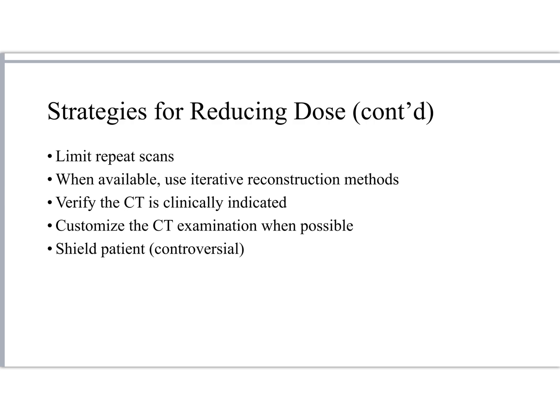Shielding continues to be very, very controversial. I've read quite a bit about whether or not we need to be doing shielding on a patient. There's an example on page 185 of the textbook on what shielding looks like for a patient. One thing I will say for certain is make sure that you do not do what this tech did and place the shield on the patient during the scout imaging. Don't do that.